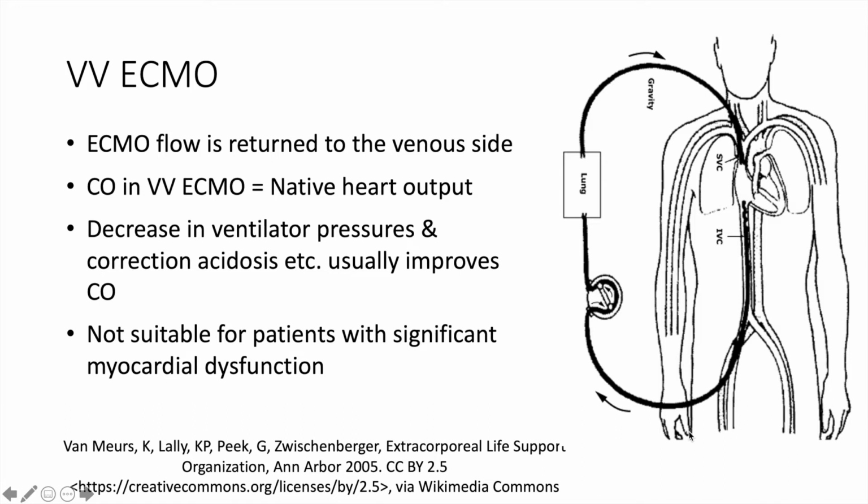Let us consider VV ECMO first. In VV ECMO, the ECMO flow is returned to the venous side. Therefore, the pump does not have any direct contribution to the cardiac output. In other words, cardiac output in VV ECMO is equal to the cardiac output generated by the heart.